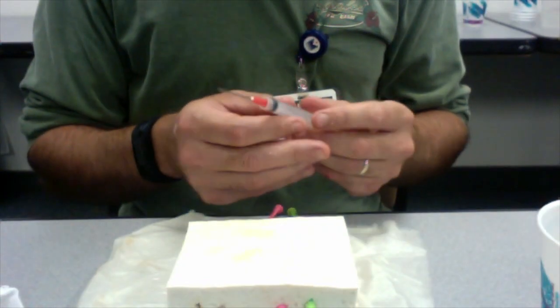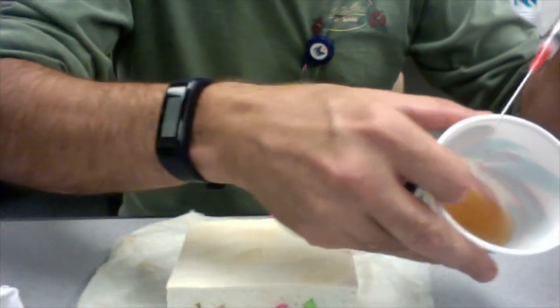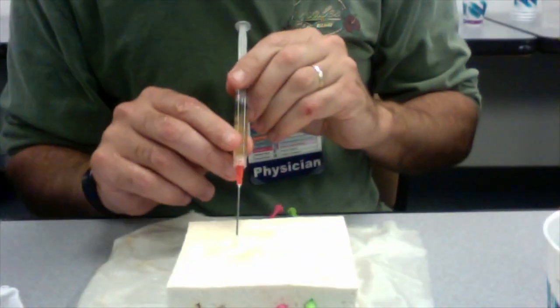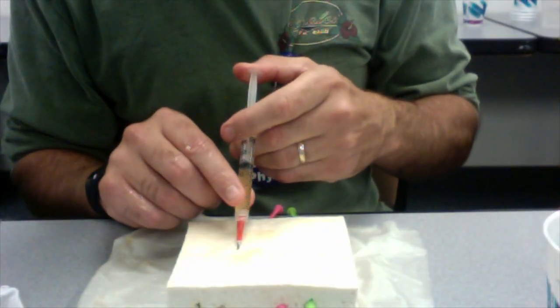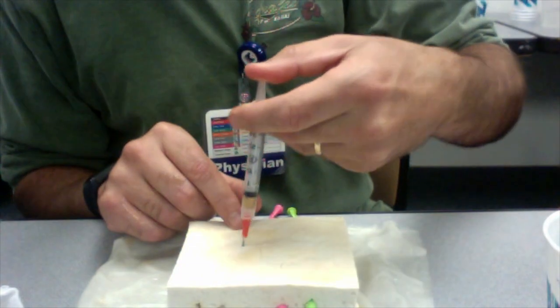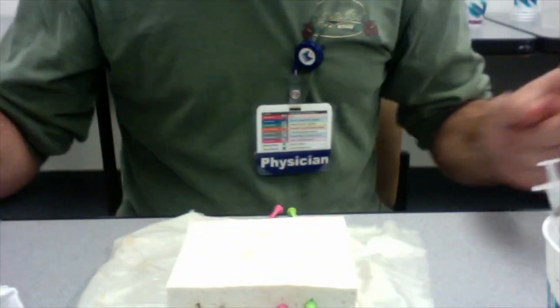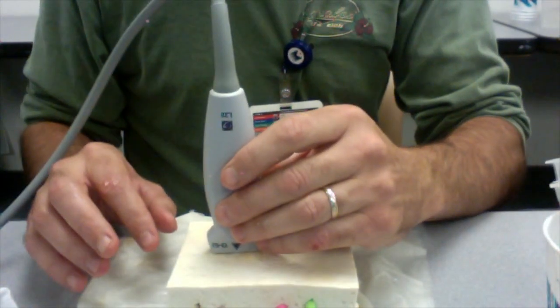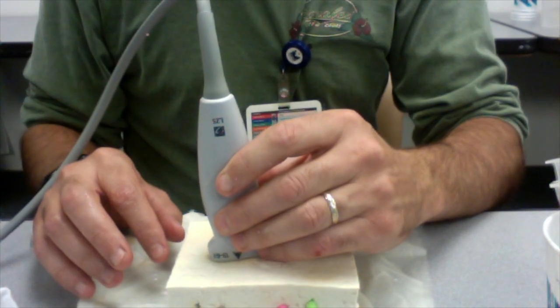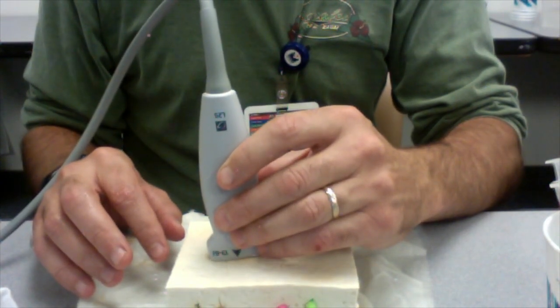Now we're going to show you how to create a model that looks like an abscess underneath the skin. Use a blunt needle and draw up a solution of Metamucil, which is psyllium fiber, then inject it into the tofu creating multiple little pockets, just like an abscess often is. You might have to practice this a couple times — it's kind of hard to get right the first time. Put your probe on there and scan it, and what you're looking for when you compress is what we call the swirl sign, which can indicate there's an abscess. When we push on that, you can see some of the material in there swirling around.